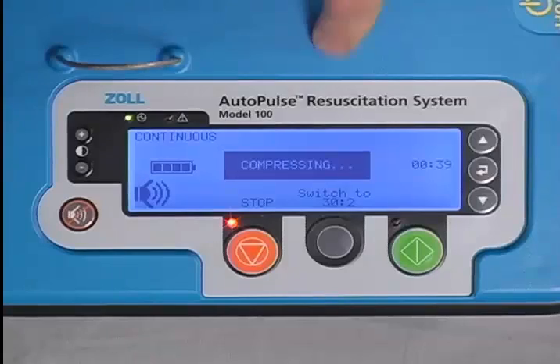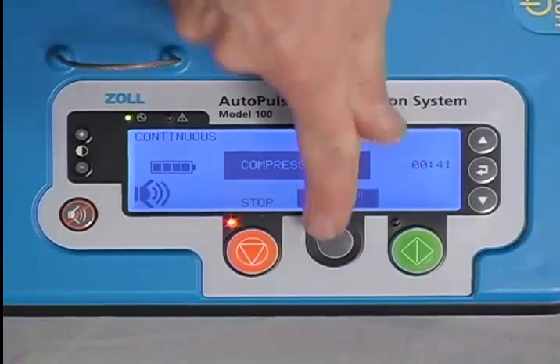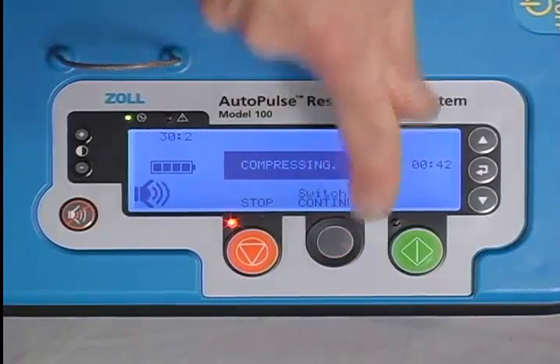During continuous mode, a ventilation tone will sound asynchronously at a rate of 8 per minute. Ventilate as appropriate during relaxation. You can switch back to 30 to 2 in the same manner.